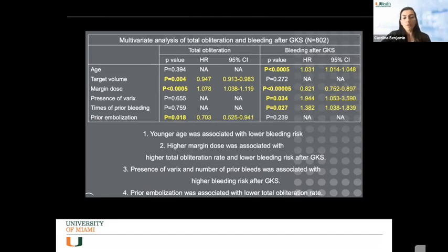The important thing is that when you're talking about radiosurgery for complex AVMs, there is a threefold problem. Number one, you want to ask, does it work? Are we getting good obliteration rates? And I think pushing the dose past 16 grays allows us to get better obliteration rates.